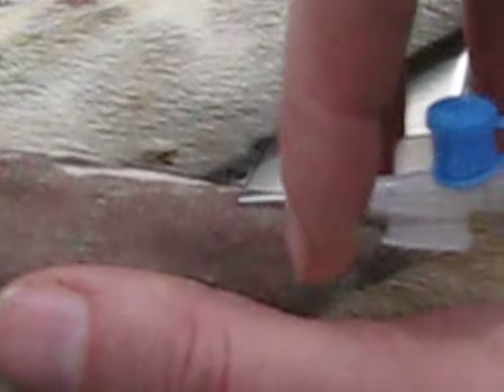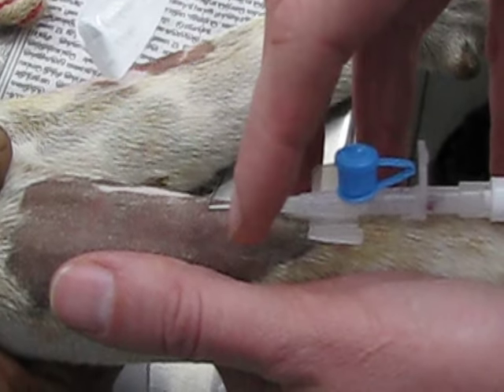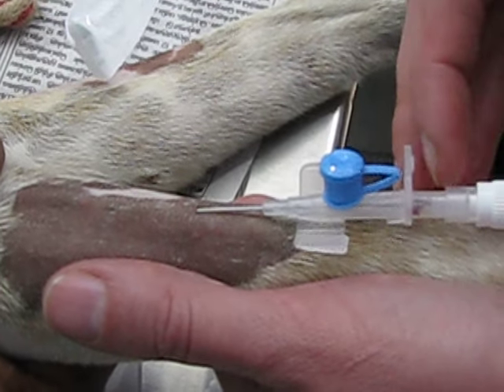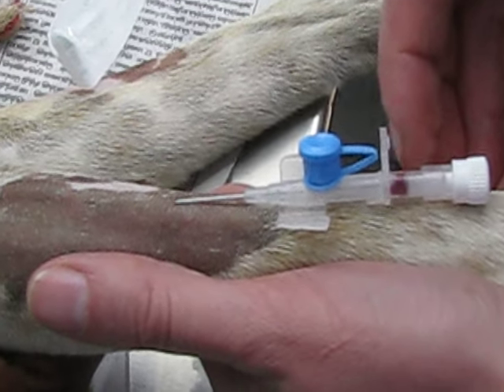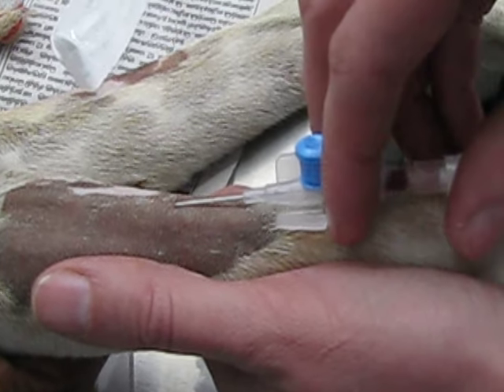We place the catheter inside. We don't try to put it in more than this — we need to see that this part, the conus, fills nicely with blood. If only a little bit comes, then it's not enough.